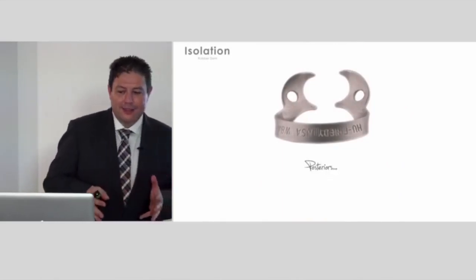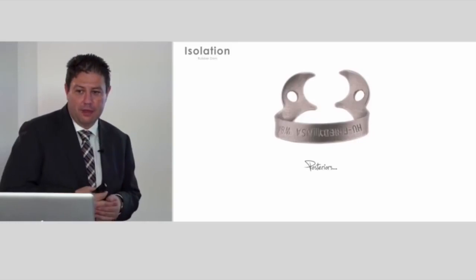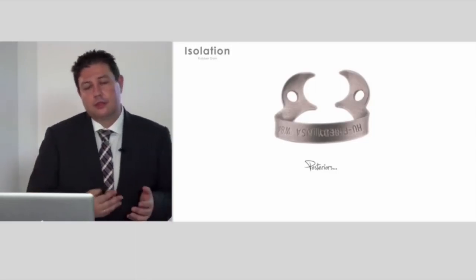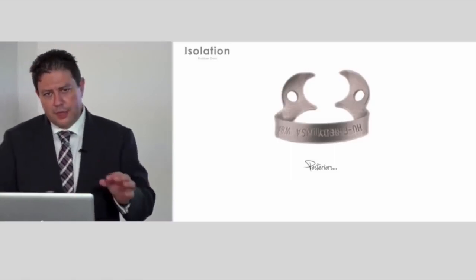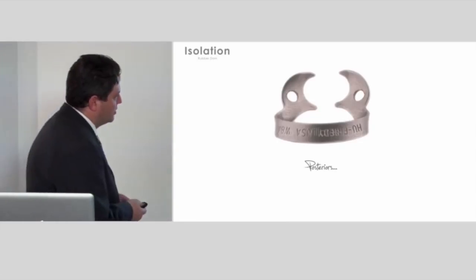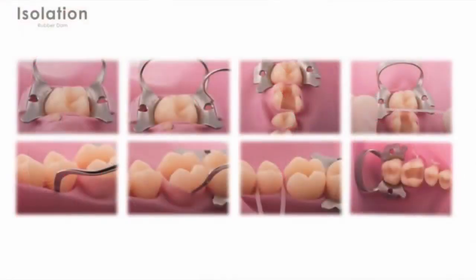If we want to simplify our system, we can say that this is the universal clamp. We can use this in the molars for posterior restoration and even for anterior, because we can isolate everything, but in anteriors we can use some special clamps to retract the gingiva and to have everything under control, but this is one of the most universal clamps that we can use. We put it first and then we go with the rubber dam, very flexible with the lubricant, and we don't have any problem. If we use other types of clamps, we put it in step by step using the floss, put it under the gingiva and floss it with a knot to have everything under control in a dry field.